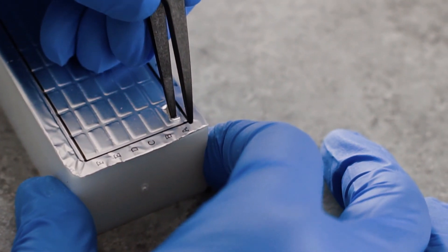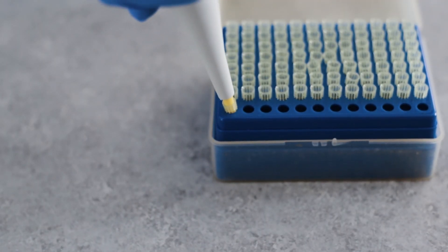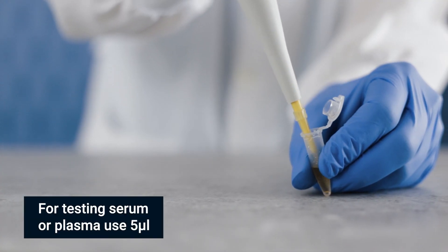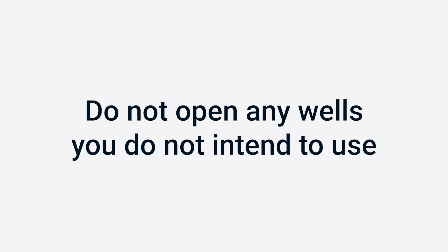Use tweezers to pierce the protective aluminum cover of row A. Use a micropipet to handle the sample. Each test requires a unique sample, so use a different sample for each opening. Do not open any wells of row A or other rows you don't intend to use. Do not remove the aluminum cover all at once.